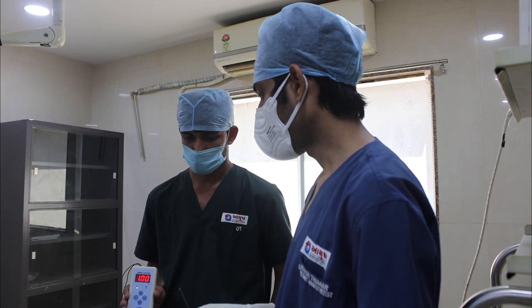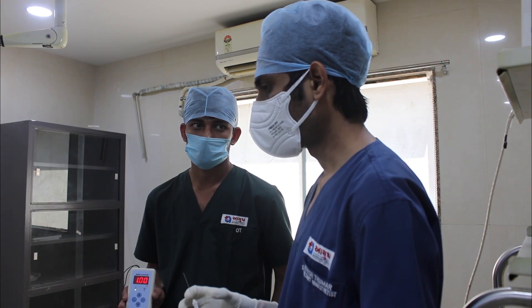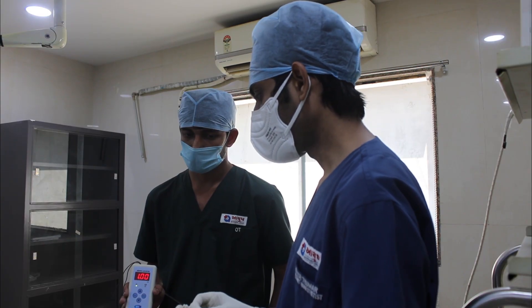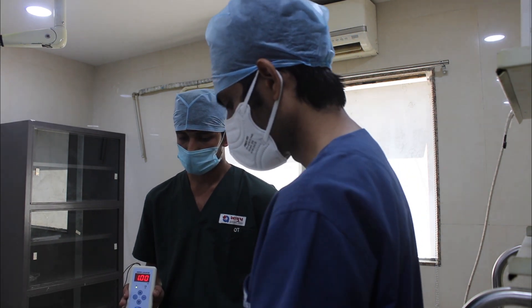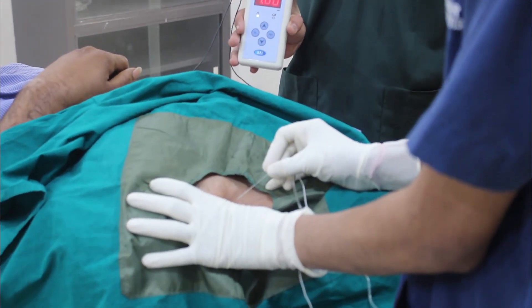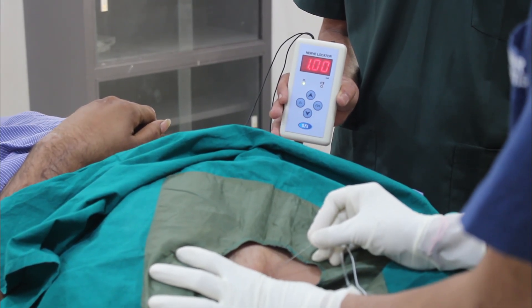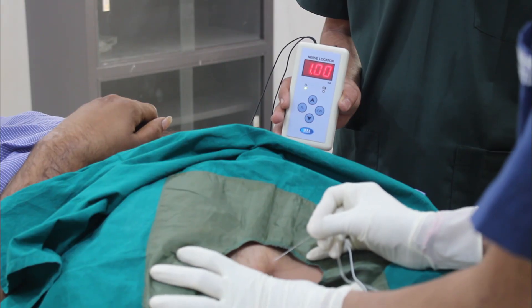Initially I am starting with 1 mA current and subsequently I will reduce current up to 0.5 mA. My desired motor response will be either finger flexion or extension of the finger at 0.5 mA current. If I get finger contraction at 0.5 mA current, that means I am in the correct plane and just nearby to the brachial plexus in the supraclavicular area. I am going just posterior and lateral to the pulsation of the subclavian artery, directed slightly caudal and lateral towards the first rib.